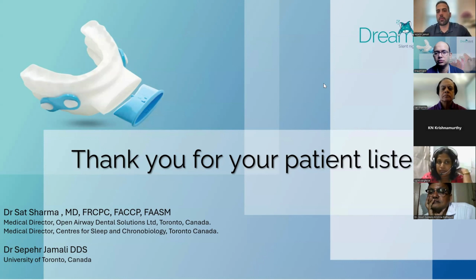Most patients, even if they breathe through their nose, still get the better benefit with the appliance, because even people who think they breathe through their nose, when they are in the supine position, if they have any obstruction of their airway, usually some higher nasal resistance is going to come, or depending on the season or any concurrent sinus infections, they may not always be able to breathe comfortably, all the time, through their nose. So having this patent airway removes all the guesswork and keeps a consistent breathing for the patient.